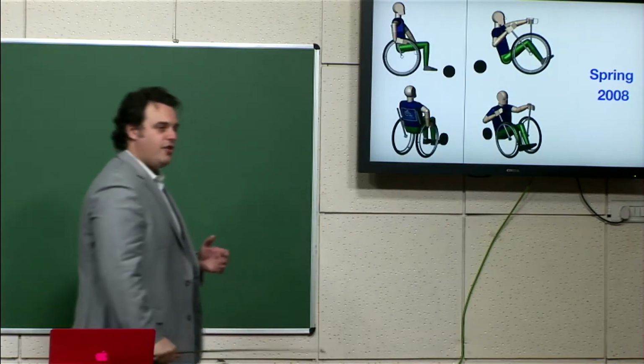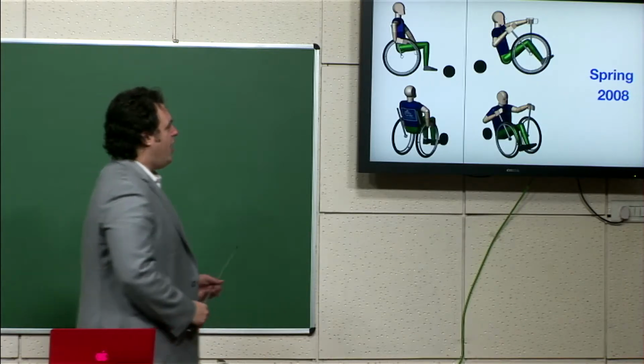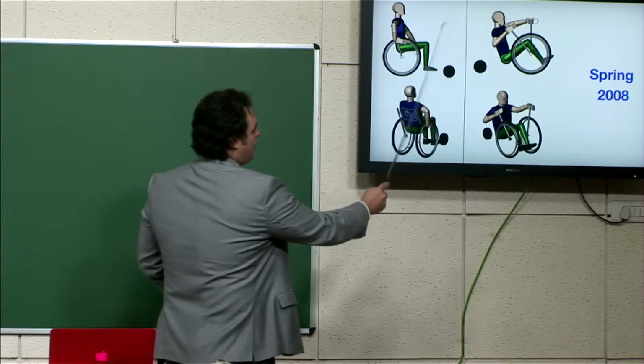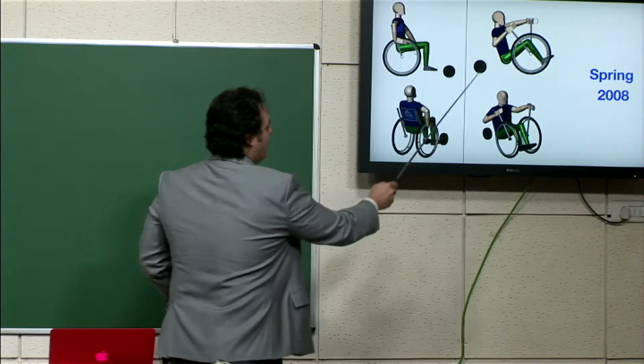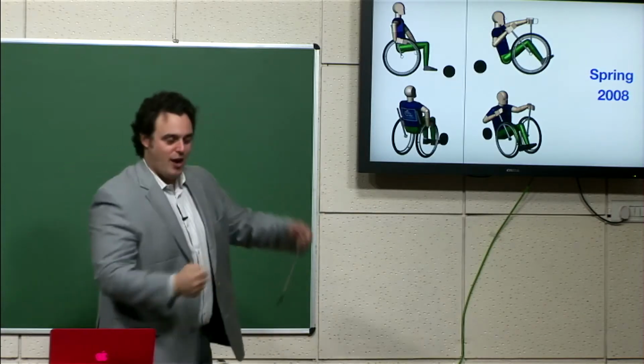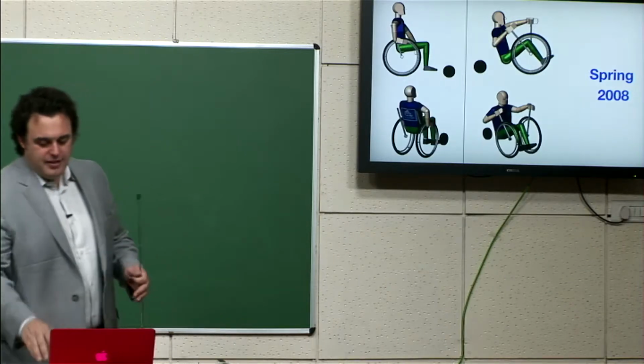The other configuration would be the off-road, all-terrain wheelchair. What we would do somehow, we hadn't figured this out yet, is spin around the seat, so you now have the big wheels in front and the small wheels in back. You can use the big wheels to climb over obstacles and go over ruts in the road. So we liked this concept.